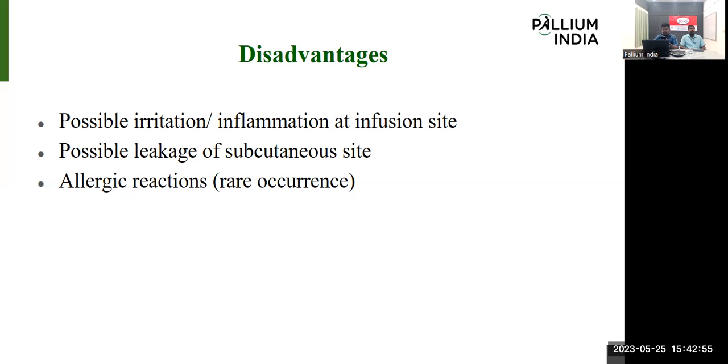Then maybe some leakage will happen. Already I told we need to assess the area for edema and whether there is any leakage or not. In some subcutaneous spaces, there will be poor fluid absorption. The tissue has poor fluid absorption, so it is not absorbing. Due to the fluid overload on that tissue, it will leak out. So there is a possibility.